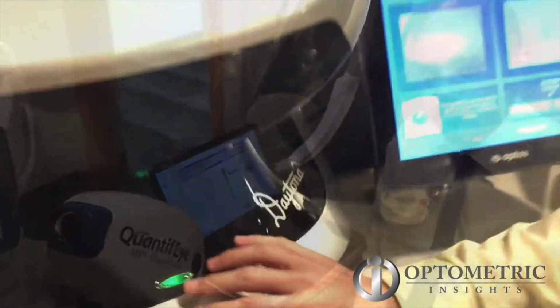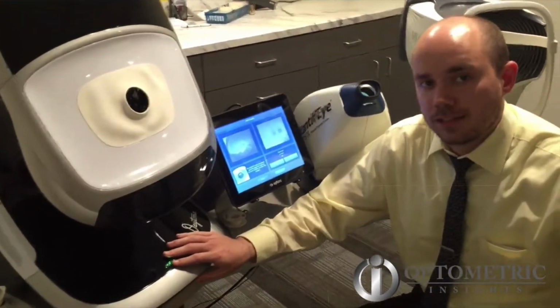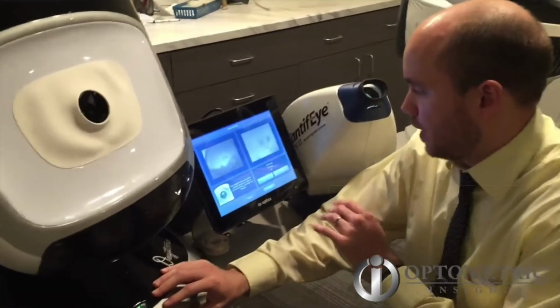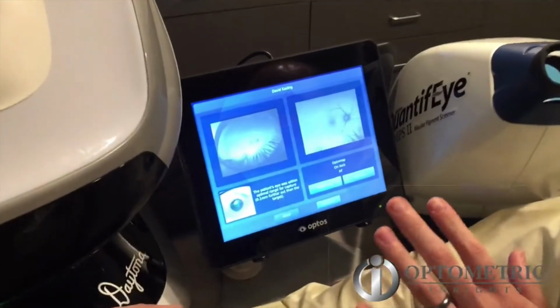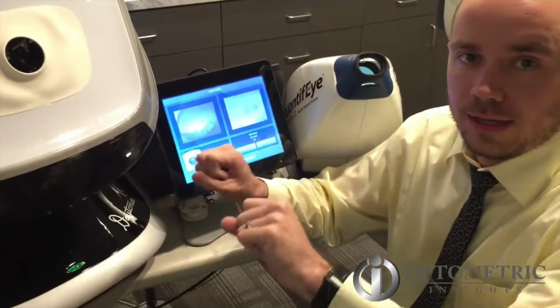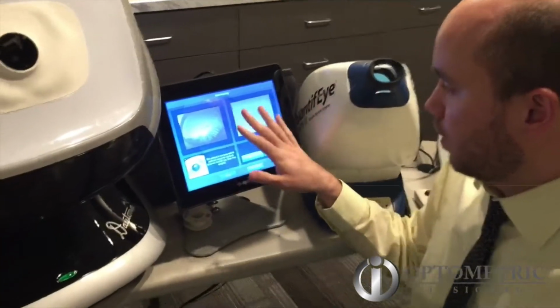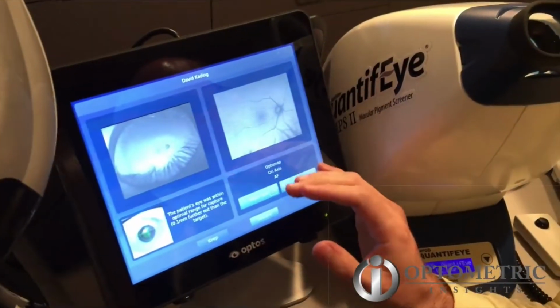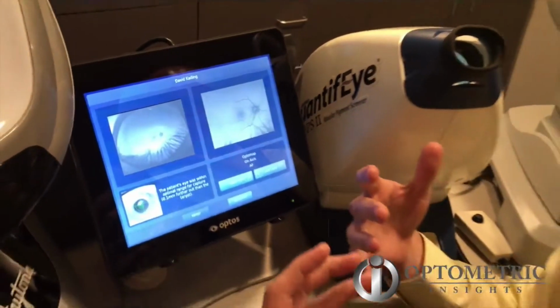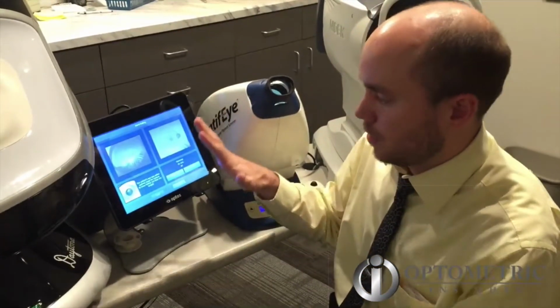So this is the Optos imaging system, specifically the Daytona instrument. And it has a really useful autofluorescence for macular health, and it obviously does it throughout the retina as well. But at a basic level, autofluorescence is looking at the RPE. Bright, hyperfluorescent means sick RPE, black means missing RPE. So a normal image should look like this with sort of the gray RPE layer you can see throughout. If it's hyperfluorescent from something like a toxic maculopathy, you'll see that right away. And then also if there's areas where there's just atrophy, that'll be gone as well. So as you can see, there's a lot of really interesting things that we can learn from this technology.